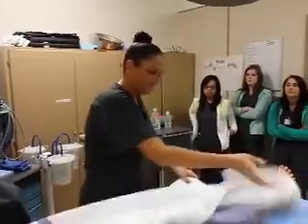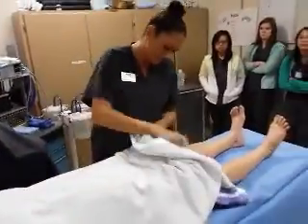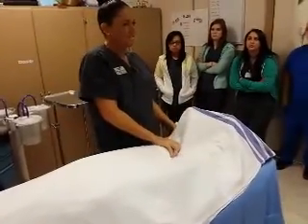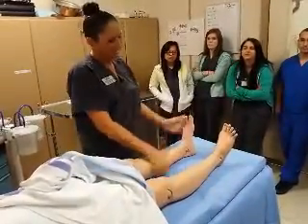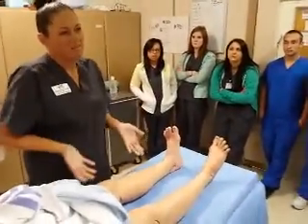All right. So, over here is asleep. You're positioning extremities. You can't really do it, I guess I shouldn't have covered them up yet. You can't really do it like this, right? With them laying on the table. Any idea why? Because you can't prep the other side.